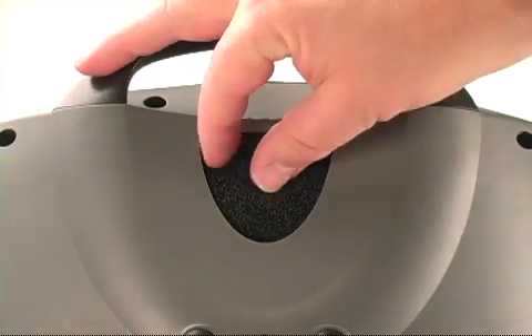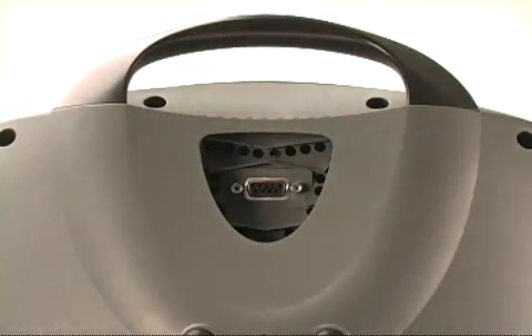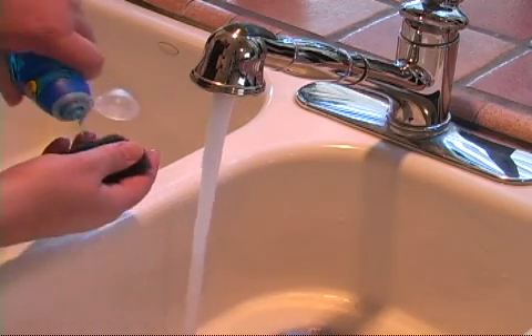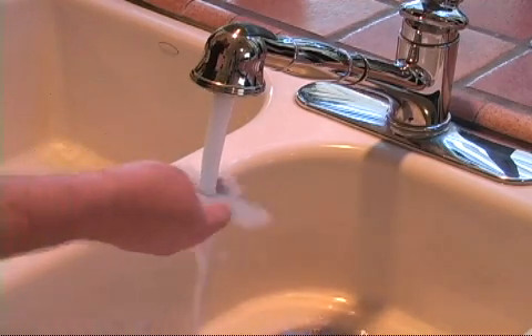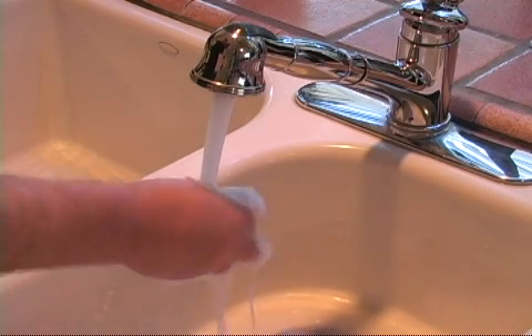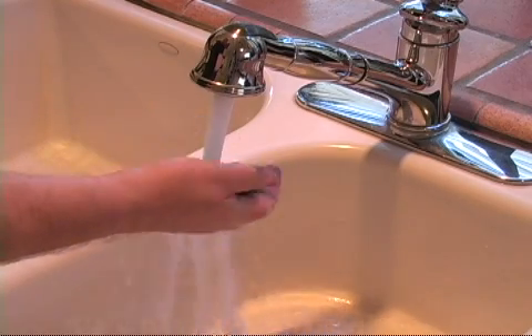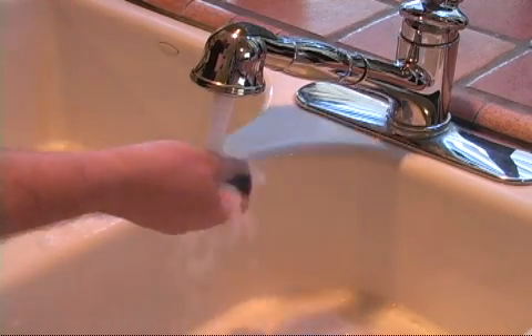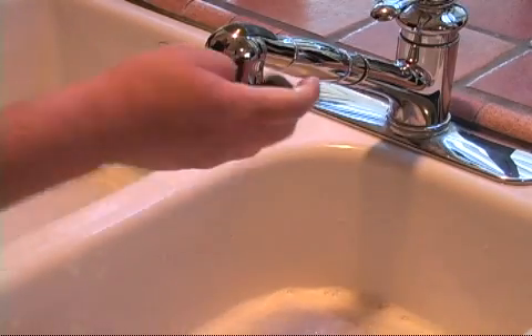To clean the air inlet filter, remove the filter from the Eclipse II housing and wash it in warm water using a mild detergent solution. Rinse the filter thoroughly with clear tap water. Squeeze out the excess water and allow the filter to air dry fully. Do not reinstall the filter until it is completely dry to the touch. Any residual moisture could damage the Eclipse II.